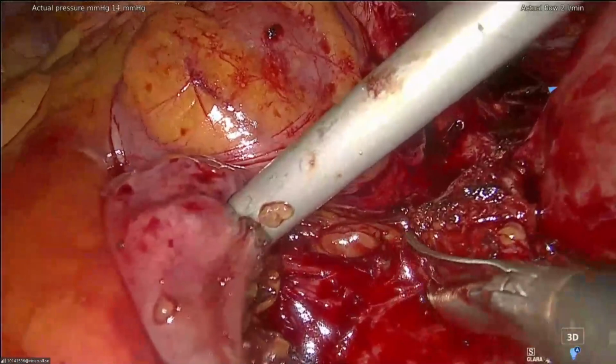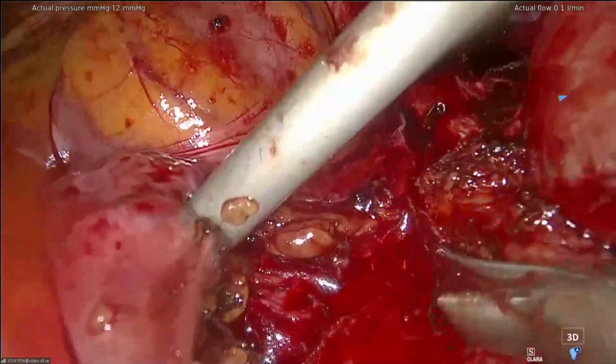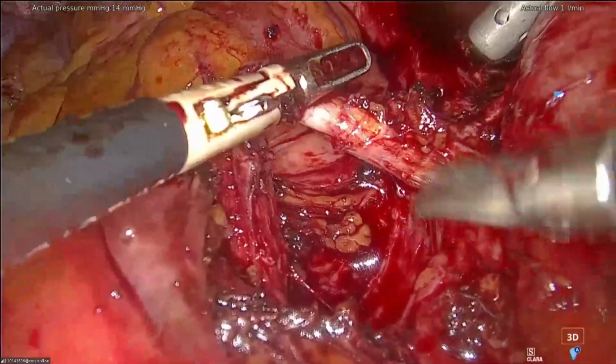It was just more surgery for me, but I think that for the patient, it's better that I take a little bit more time. Yeah. Because of course, the question is, in this kind of patient, we can have a very bad surprise and find a distal tumor in the ureter. It's a good candidate for that because there is a CIS on the right ureter, so maybe you develop a tumor here that you cannot visualize due to the lack of contrast, and that happens also.